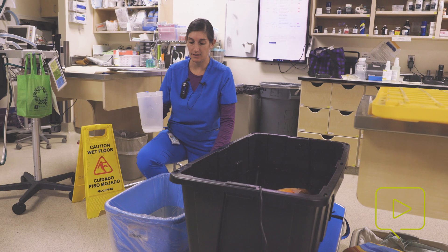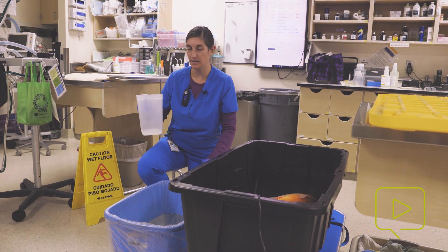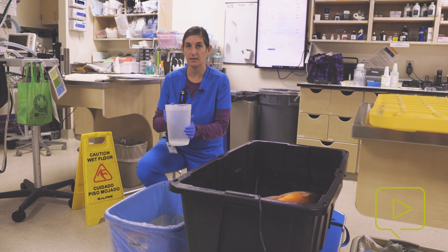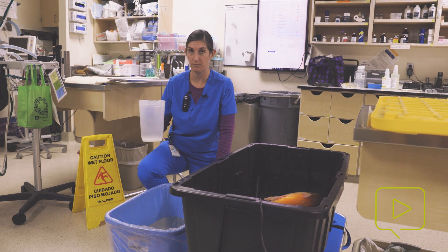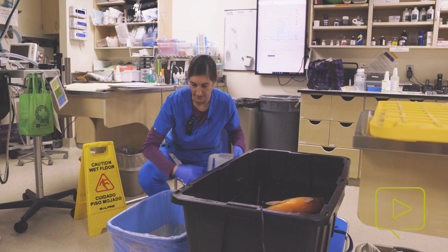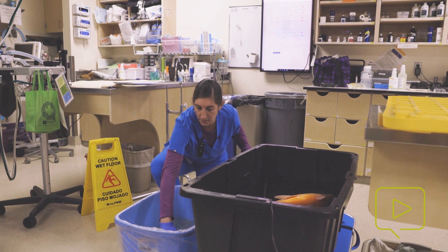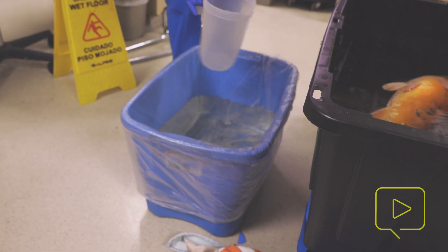If it isn't quite enough and she's still awake, then we can add an additional 150 milliliters to create a 100 milligram per liter solution. So I'm going to go ahead and add this in here and just agitate it quietly. And now we're ready for our fish to go in here.